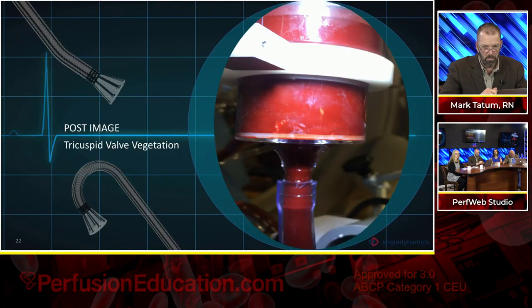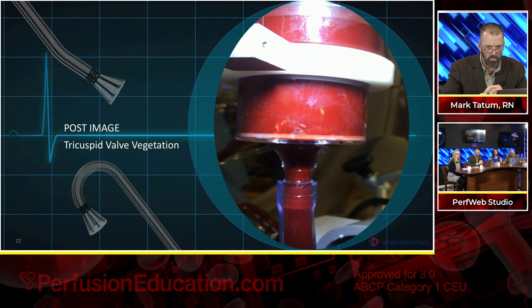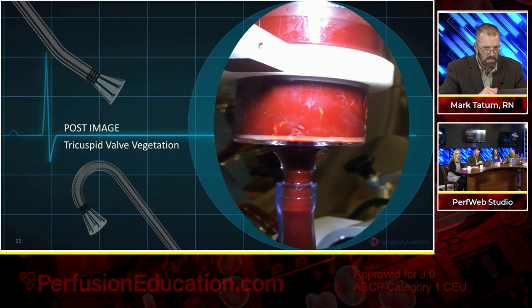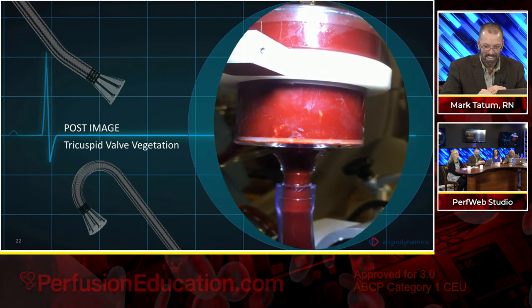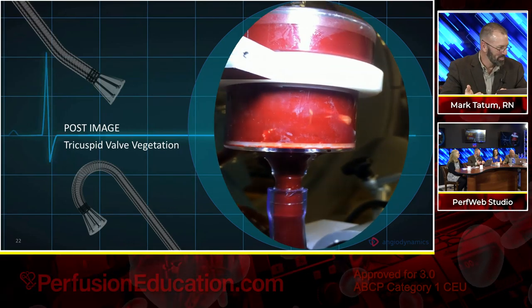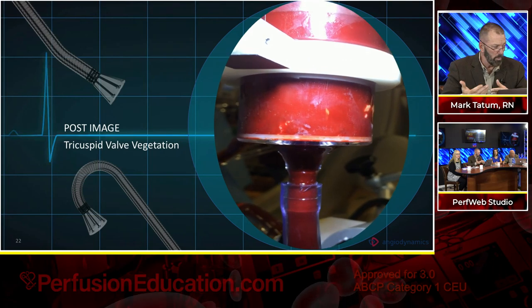This image that you can see, if we click one time, whether or not we're going to swirl? Ah, there it is. There you go. Yes. So I see the gradu. Yeah, indeed. That's a Louisiana medical term. Gradu. So you can see the material floating around.